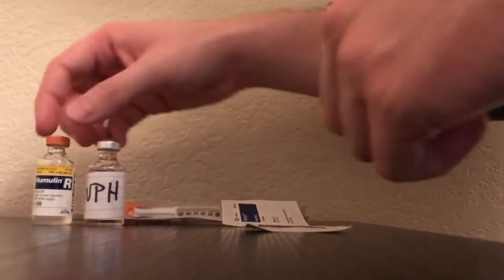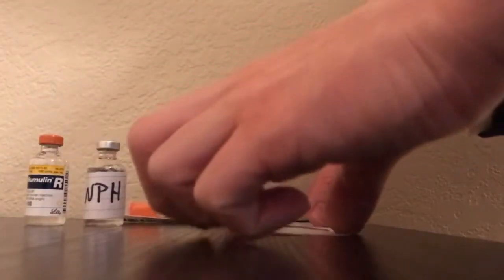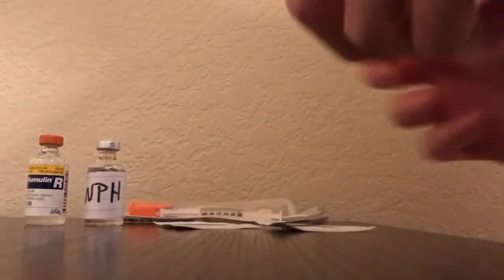How to mix insulin. Get your materials: your Humulin or clear vial, your NPH cloudy one, your insulin syringe, and two alcohol swabs. Verify the order with your MAR and the physician's order.